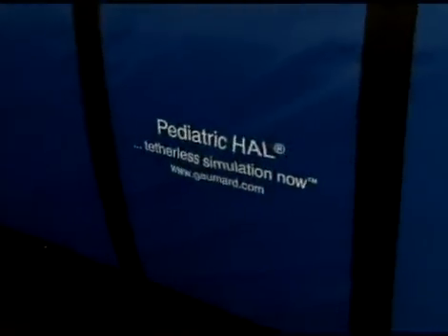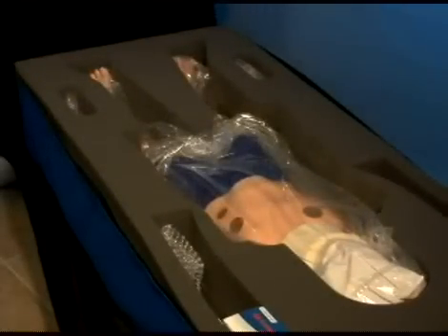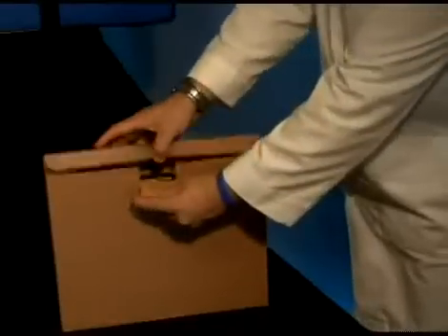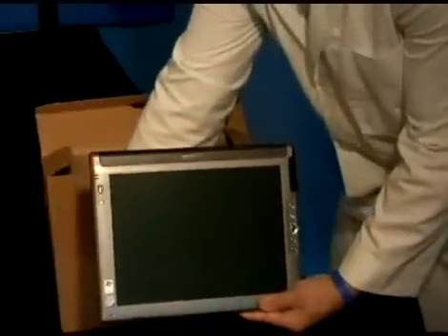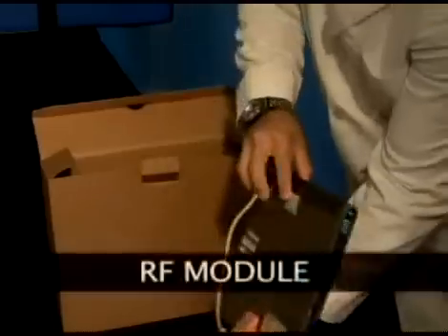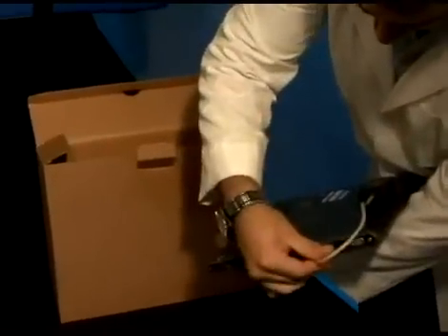The first task following the arrival of your new Pediatric HAL simulator is to ensure you have received all the equipment and accessories. Remove the tablet computer, which is packaged separately, and connect the RF module to either one of the USB ports on the left side of the tablet.